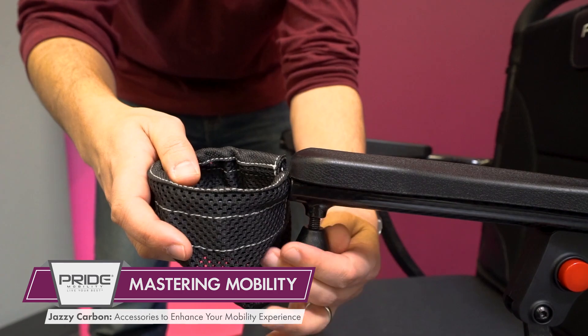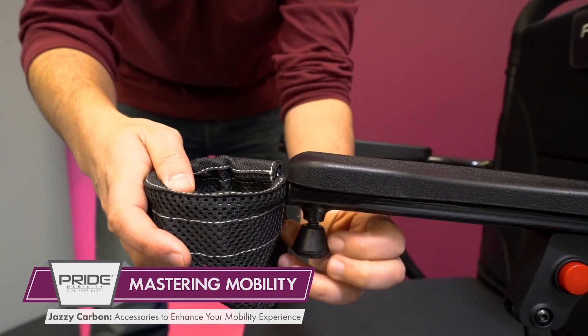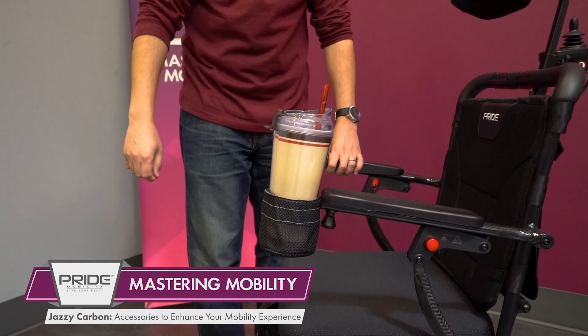And third, this mesh cup holder was designed specifically for the Jazzy Carbon and fits perfectly onto either arm of the power chair. It's secure and will hold your beverage so that you won't go thirsty throughout your travels.